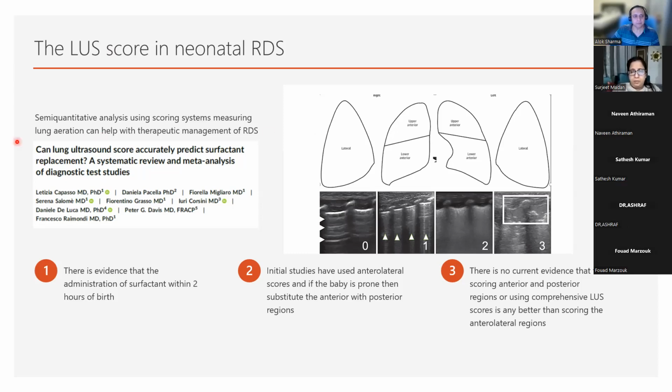I probably, I'm still on annual leave, and so I've not started using lung ultrasound routinely. But from the evidence you've presented, and also looking at all the pictures, FiO2 at best is a predictive factor for how bad the lungs are. It can be very subjective. So I would believe lung ultrasound is a more objective way of defining RDS than FiO2.